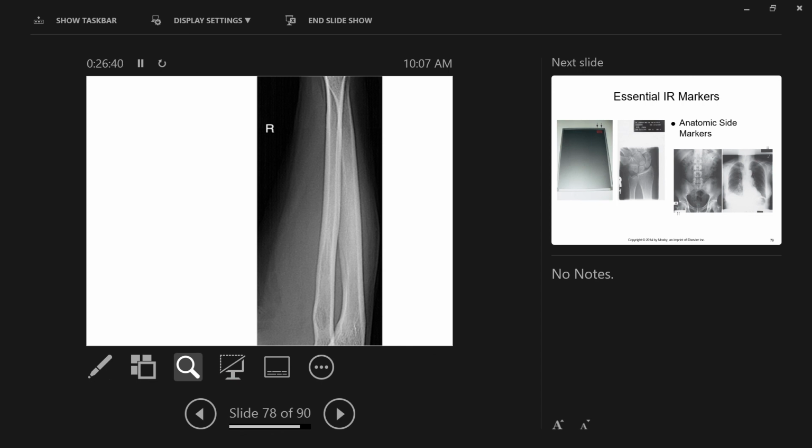What about regarding the bony anatomy? What are you looking at? Maria, what are you looking at for bony anatomy? I forgot what it's called, but it's basically like the shadings. Yeah, I don't know what it's called. I've got the bright white bony cortex, all of that white on the outer layer of the bone. That's the bone's cortex, right? The hard outer layers of the bone. So bright white bony cortex.